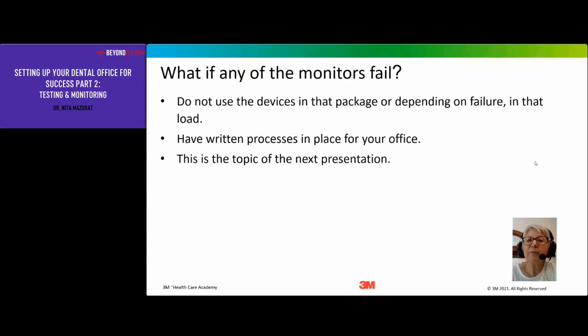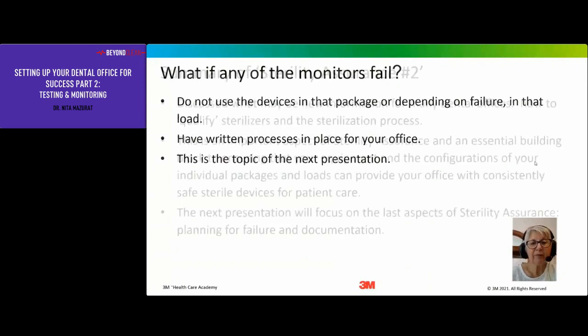If any of the monitors fail, do not use the devices in that package or, depending on the failure, in that load. And you need to have written processes in place for your office. That's going to be the topic of our next presentation.